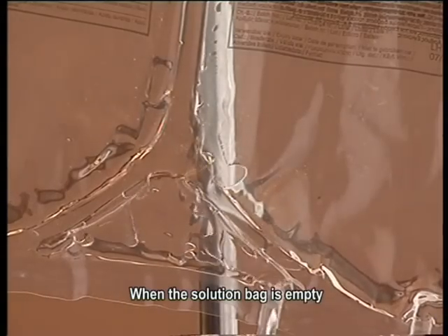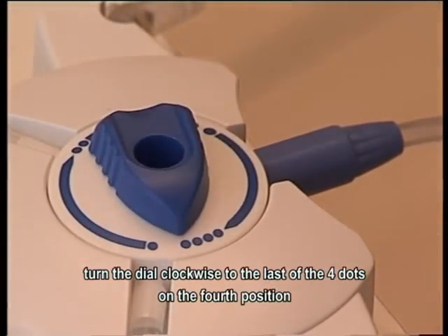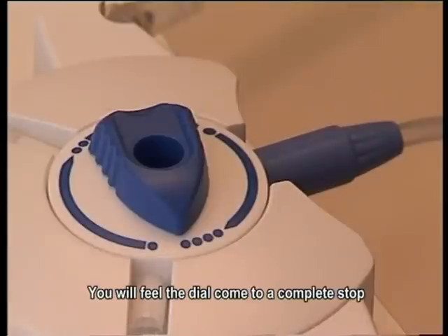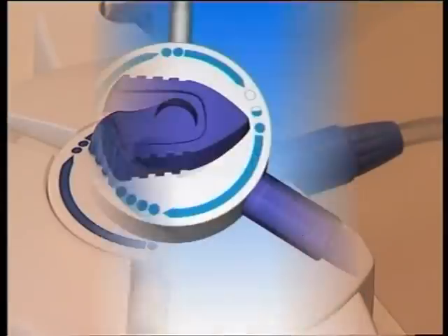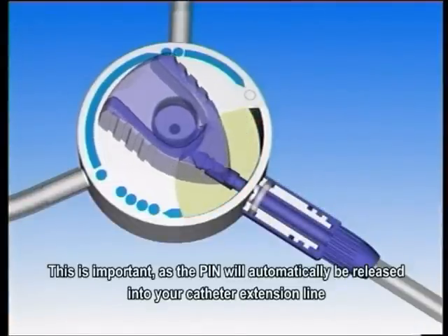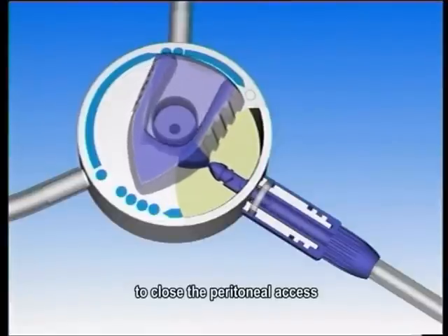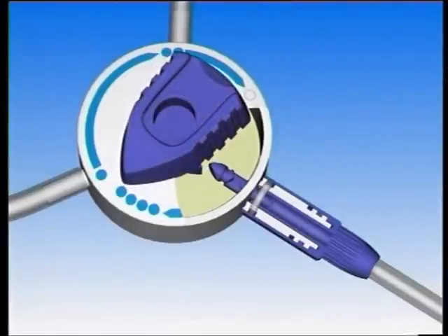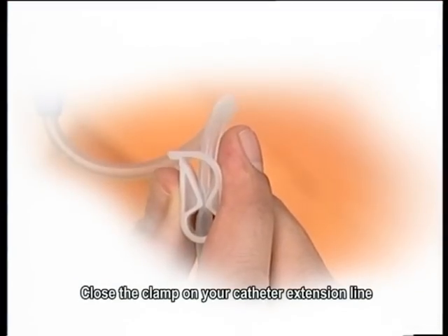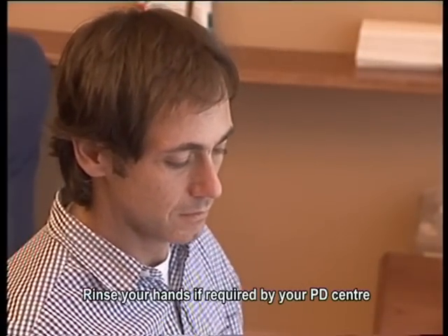When the solution bag is empty, turn the dial clockwise to the last of the four dots on the fourth position. You will feel the dial come to a complete stop. This is important as the pin will automatically be released into your catheter extension line to close the peritoneal access. Close the clamp on your catheter extension line. Rinse your hands if required by your PD center.